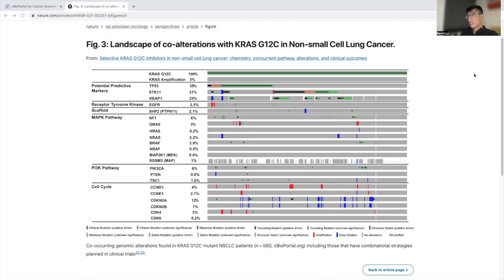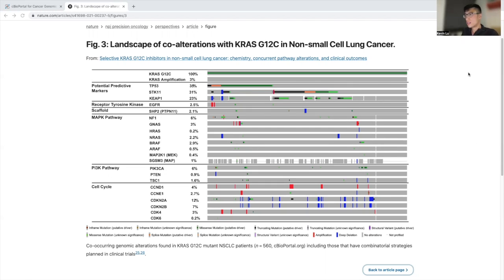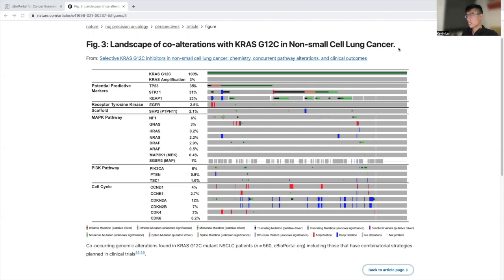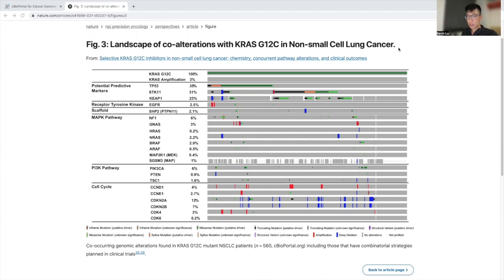And what you see is an image, an oncoprint that we published. With the oncoprint we were looking at the co-alterations associated with KRAS-G12C non-small cell lung cancer. I wanted to demonstrate how to make oncoprints so you can also look at certain genes and see how they represent in terms of related co-alterations as well.